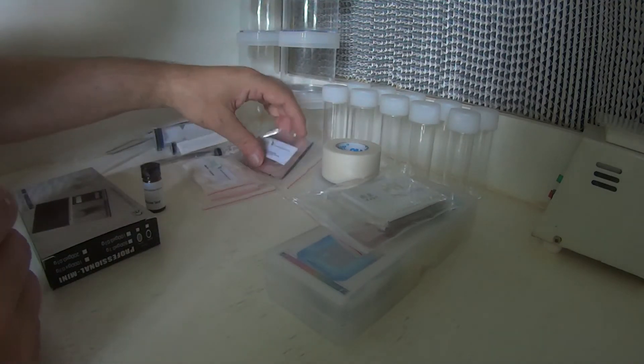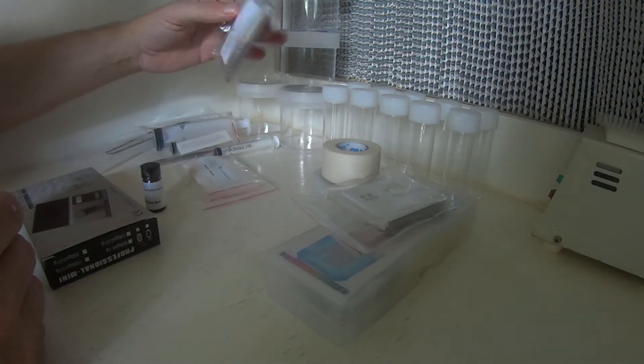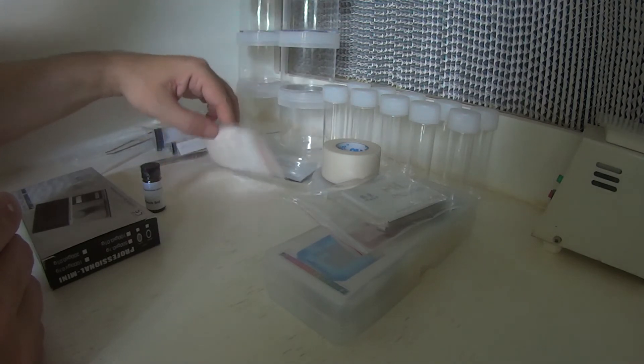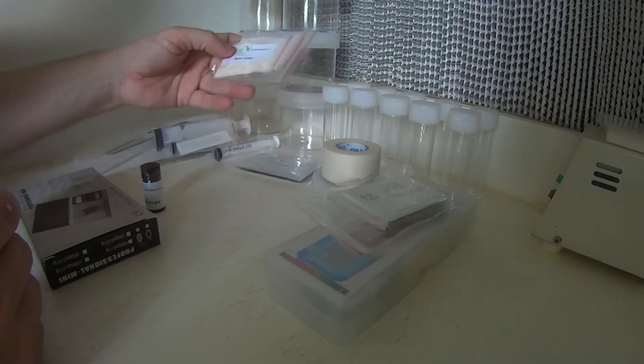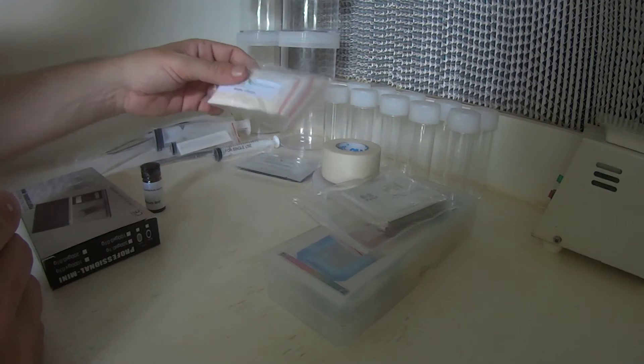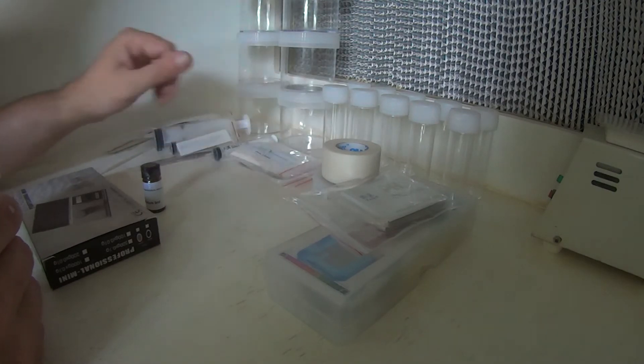In this kit, we also include three packets of MS salts. Each packet's enough to make one litre of media. We have three packets of Gel-Rite as well. One packet of MS to one packet of Gel-Rite and one litre of water, and you have a litre of media.